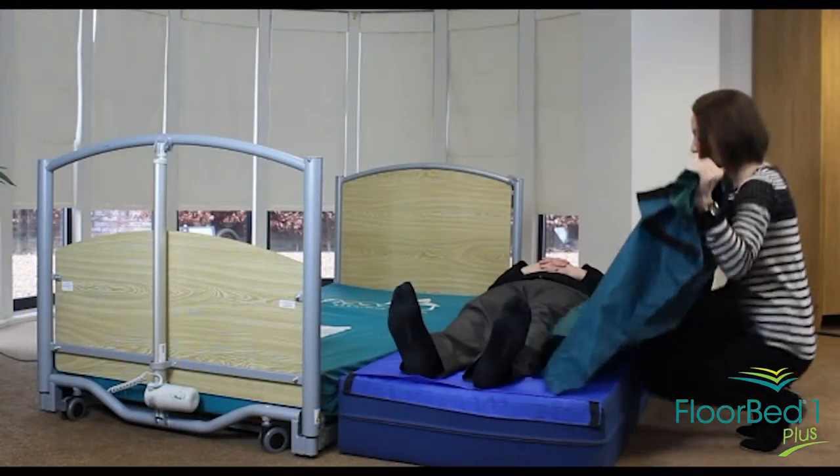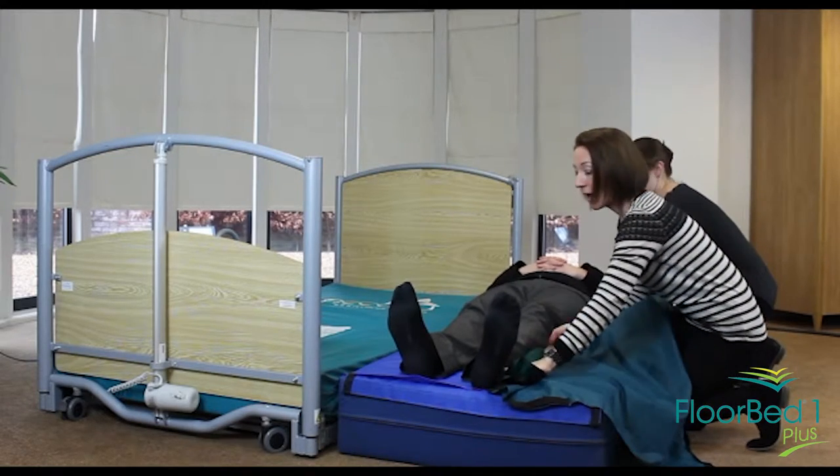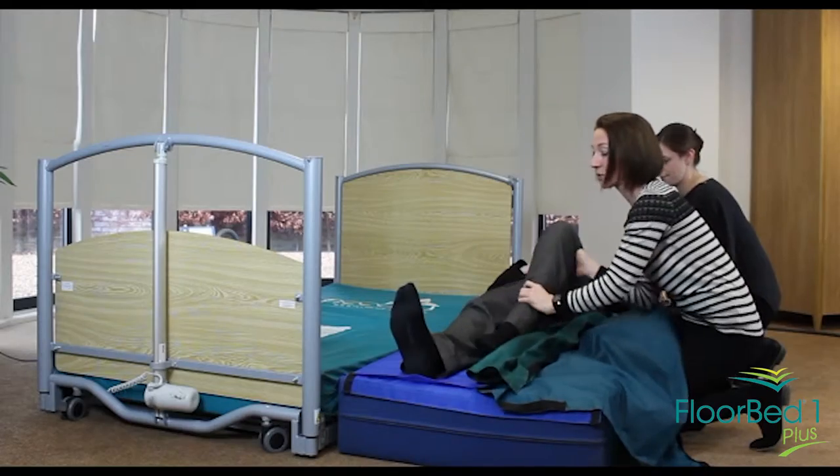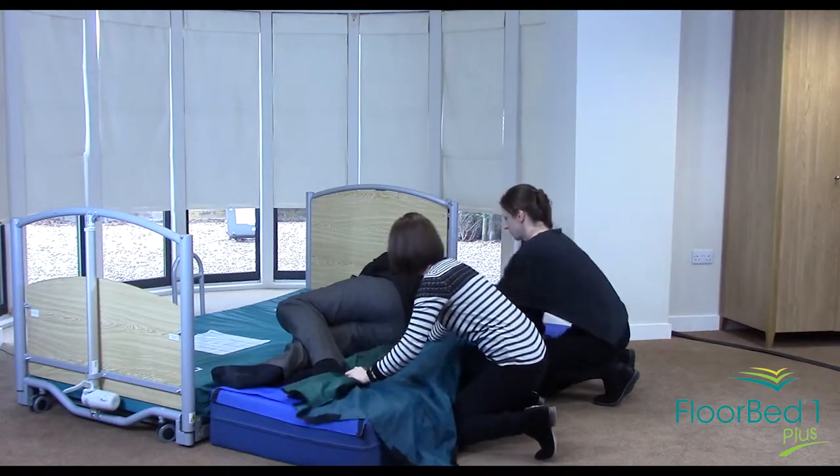We then come alongside the patient, lay the sliding sheet alongside the person, and then we're going to get ready to roll so that we can place the sliding sheet underneath.